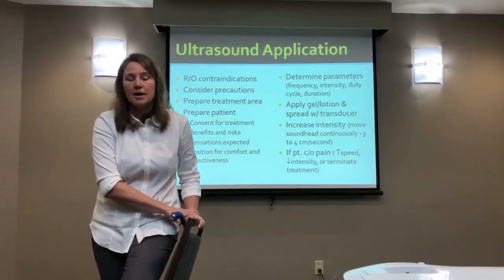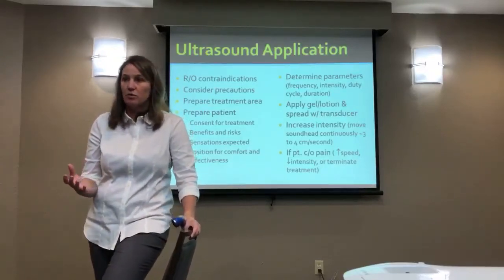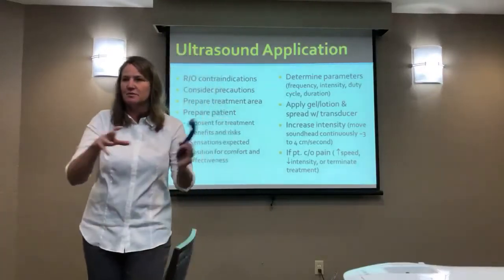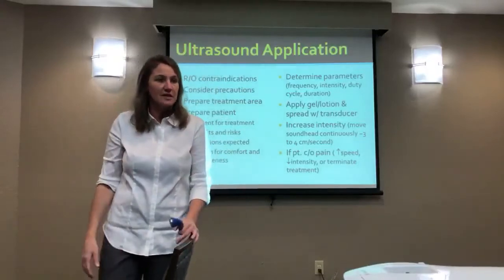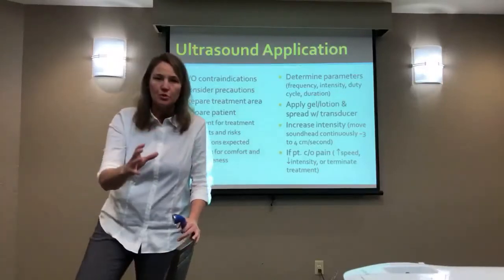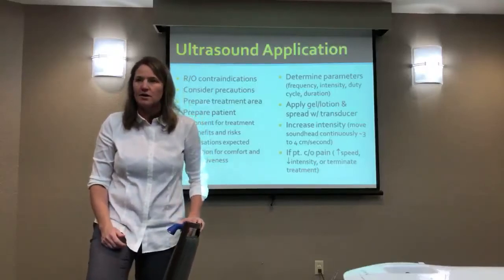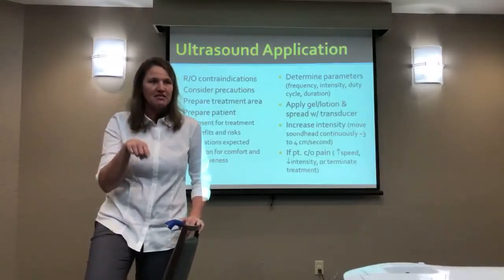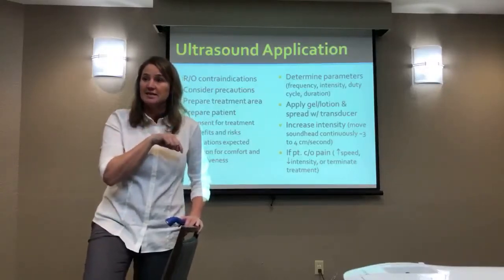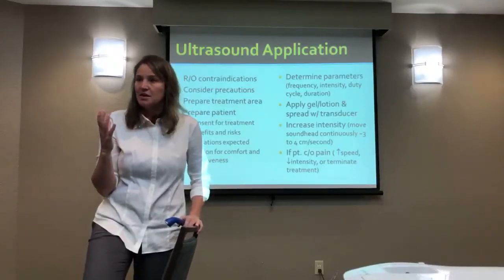Determine your parameters. It matters that you look confident. I've had to go in and do things before where I was like, I hope I can pull this off, because I've never used this thing before. Have you ever had to use some device or transfer device that literally took 2 minutes to figure out how to use? Well, clearly don't do it if you don't feel confident. But if I haven't used a machine in a while and I turn it on and it's going to take me a minute to figure out how to maneuver through the parameters, I'm going to try and do that where they can't see me, because I don't want them to see me looking not confident. You know what I mean? So I'm going to try to protect them.